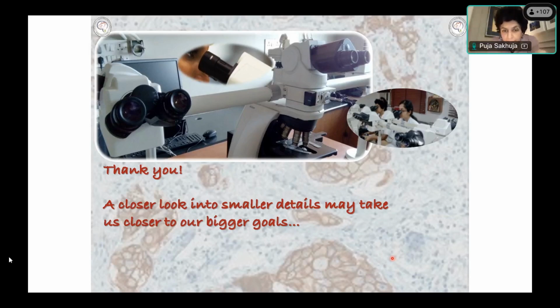Is it a small microgranuloma that is about the size of a crypt or 100 microns, not necessarily very well defined, although this is not an all or none. This is usually how the granuloma in Crohn's looks.